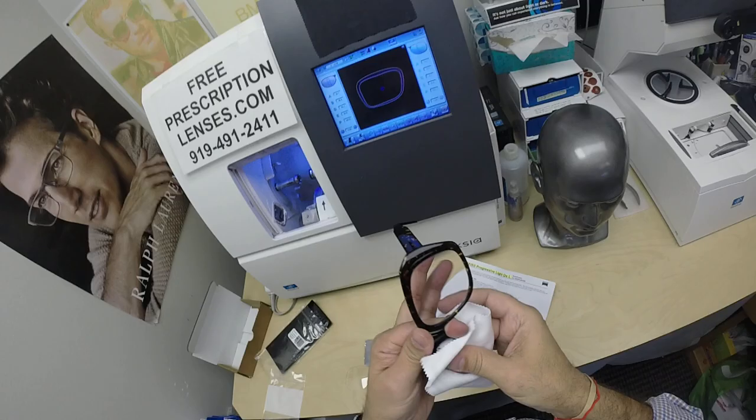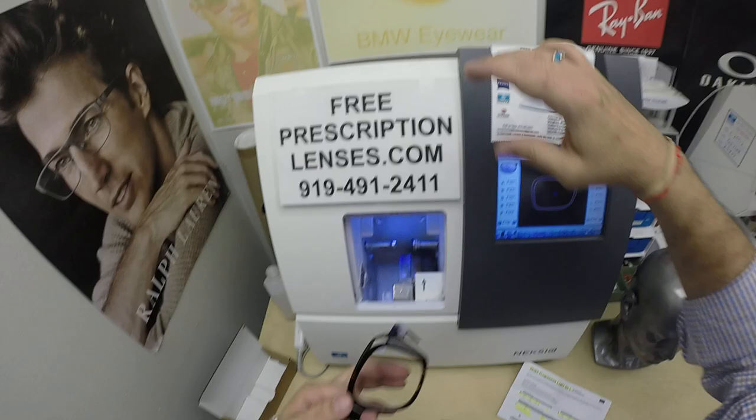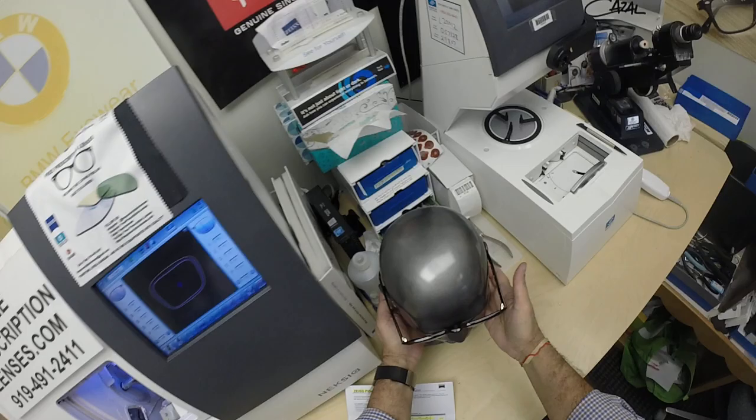This is probably the largest frame that I sell. The Ultra 1, model one, comes in a 57 eye size. This is the 62 that I affectionately call the windshield. Look at this thing. Hence the term Goliath — this is as big as they come. This is what they look like clear.